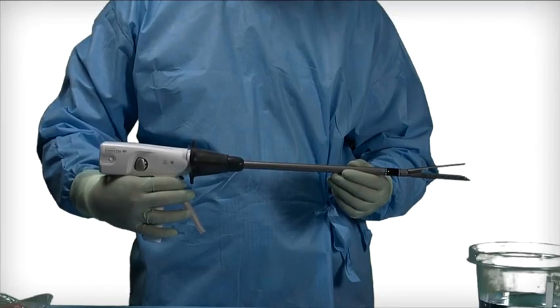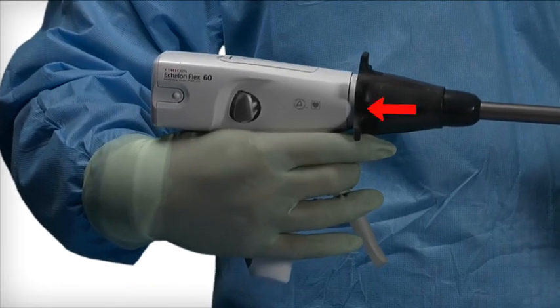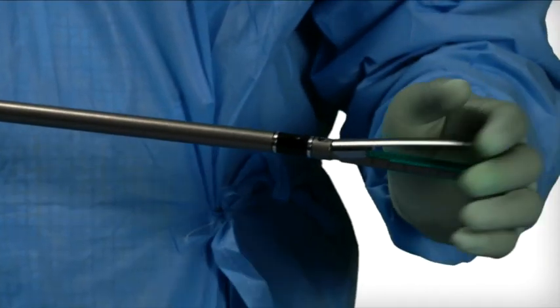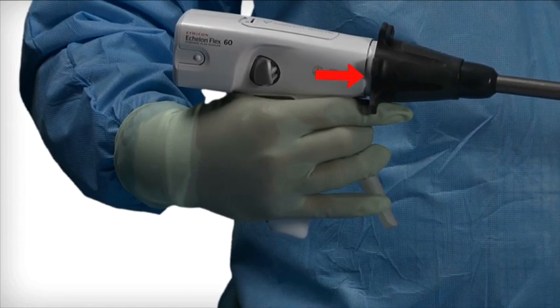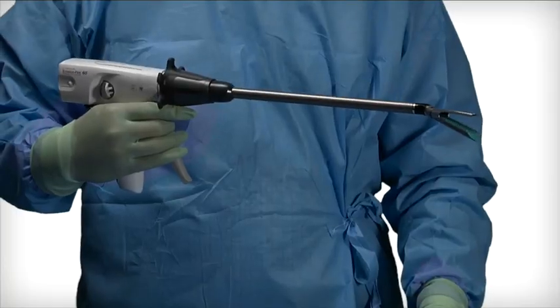Articulating. After ensuring the jaws are in the open position, pull back and hold the articulation fin to activate the articulation joint. Apply lateral pressure to the jaws to articulate the device. Release the articulation fin to lock jaws into the articulated position. The device is ready to use.